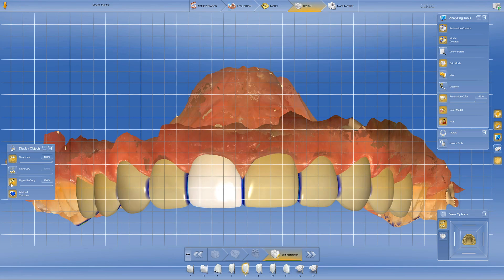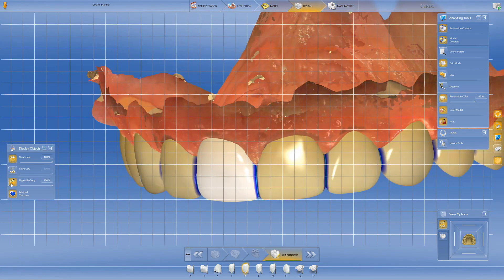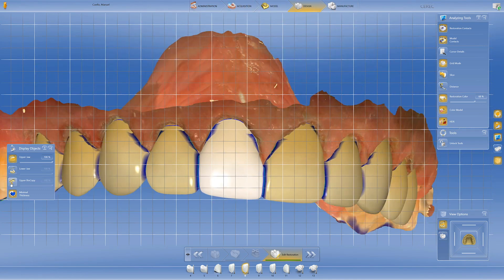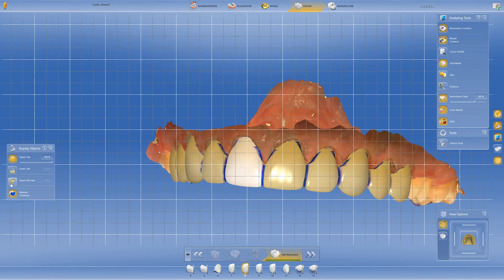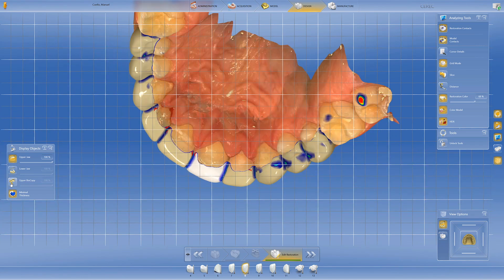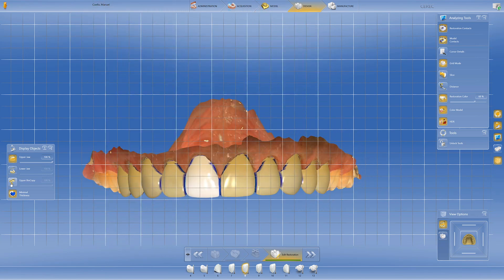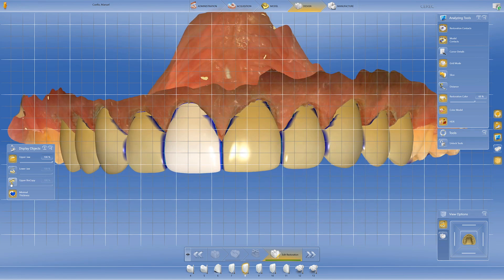The first thing we did is take some images in our CEREC machine, where you can visualize your entire smile in 3D. While that is super helpful, the coolest thing is that this can all be done in a single visit because of this technology. We're imaging, designing, and making your smile in one day — this guy left in three or four hours with a brand new smile.